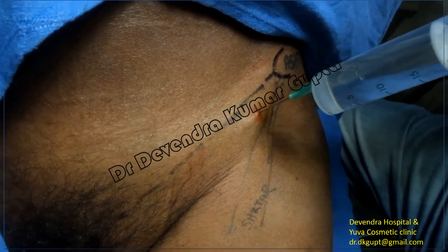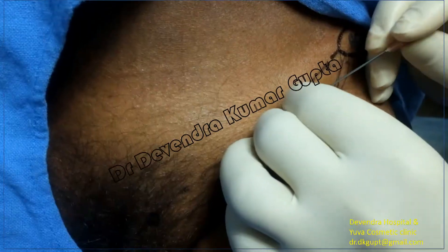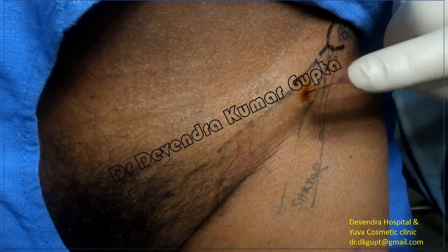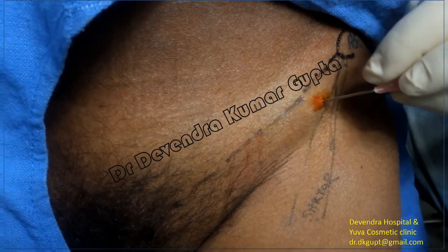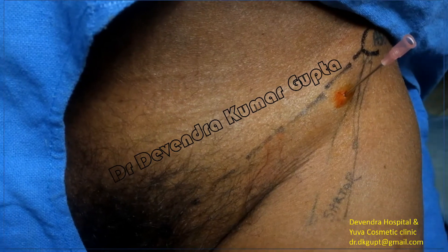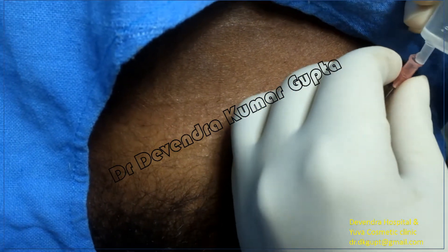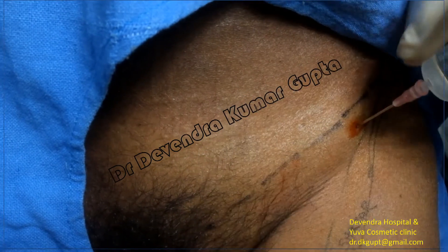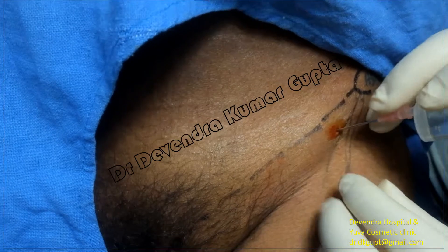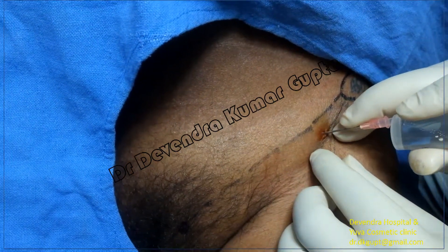Inject a small amount of solution to anesthetize the skin and underlying fascia lata, then remove it and insert the needle. Now the needle is jumping over the fascia lata. Attach the loaded 20 ml syringe — I can feel the resistance of the fascia lata — pierce it, and there is a pop.